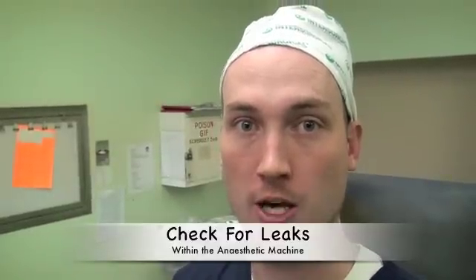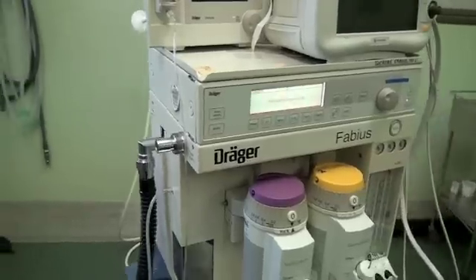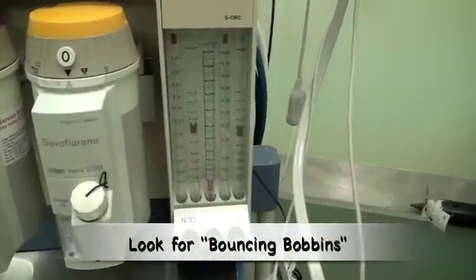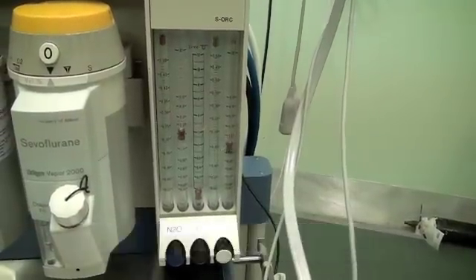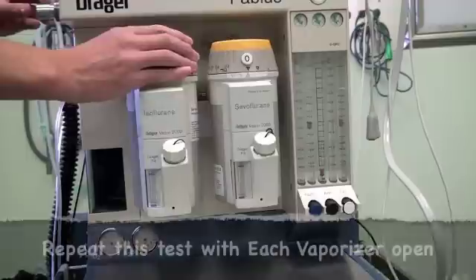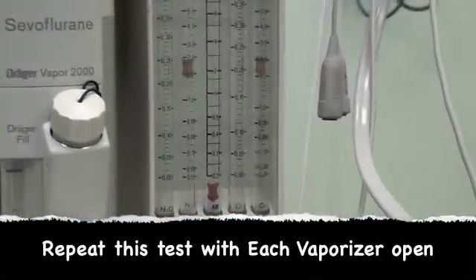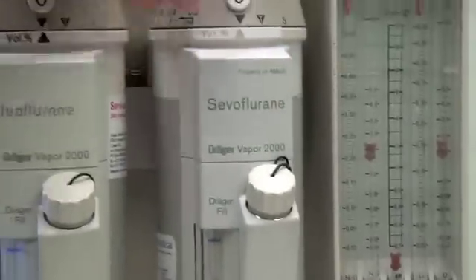Now that we have checked gas supply to the machine, we need to check for leaks within the machine. On the Fabius machine, this is done by disconnecting the common gas outlet, then occluding it while watching the bobbins on the rotameters to ensure they are bouncing up and down — this indicates no leak. The test must also be repeated with the vaporizers open; the bobbins should still bounce and no leaks should be heard from around the vaporizer. This is repeated with each vaporizer.